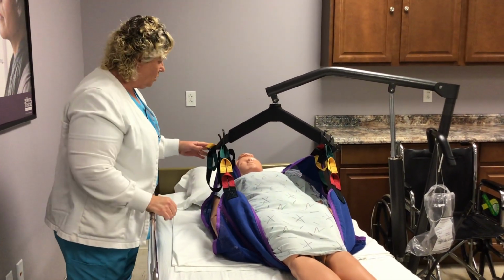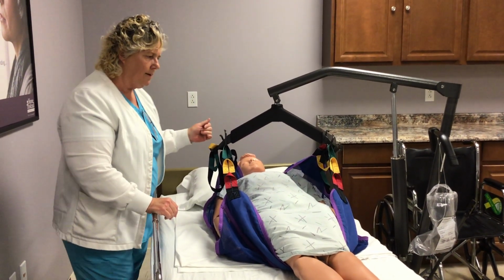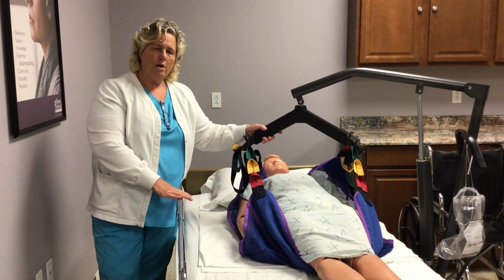The reason I chose to use the red is shorter. It's going to pull the head up into a sitting position. We're going to stop the video at this time, and I will continue on part 2.